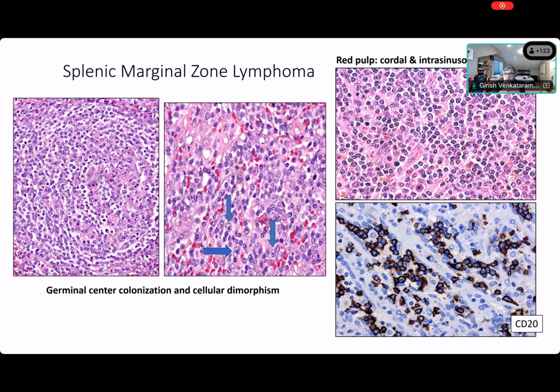And of course, you need to learn how to identify FDCs in the lymph node germinal center. They are typically doublet cells where two nuclei kind of touch each other, what we call kissing cells. They're very easy to identify in the lymph node on H&E. And it's important for you to know how to distinguish and identify an FDC because that becomes important in the context of follicular lymphoma grading, so as not to mistake FDCs to be centroblasts. Otherwise, you'll be constantly overgrading your follicular lymphomas. But that's besides the point of the spleen lecture.